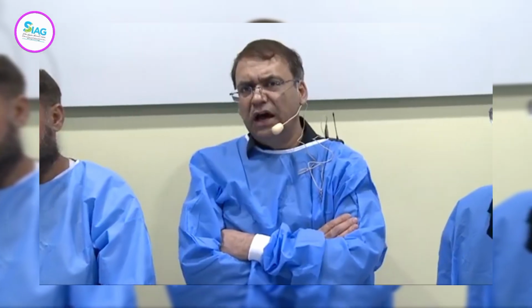Let's say Crohn's disease, with EUS? I think it becomes difficult to know what you are looking at. If you see the fistula orifice clearly, you put the balloon on that, then you can assess it. I'm talking about the internal rectal fistulas. But other times, it can give you a clue.